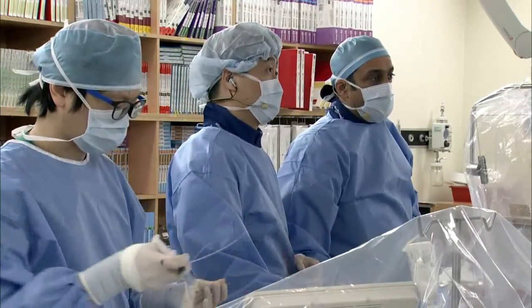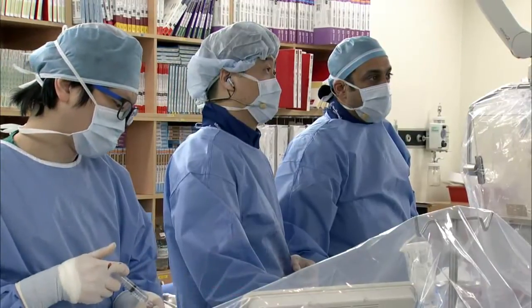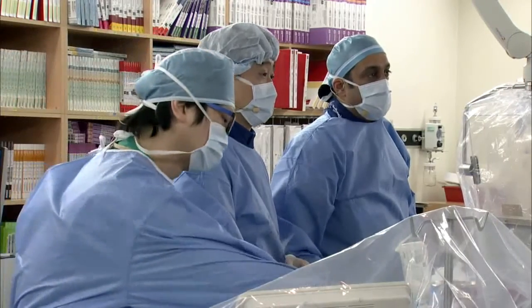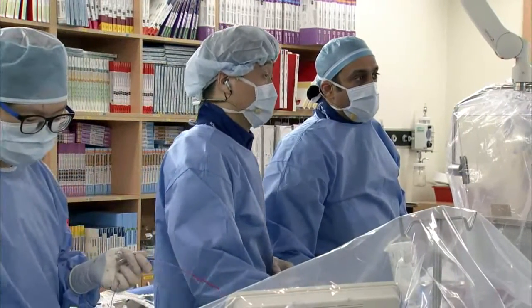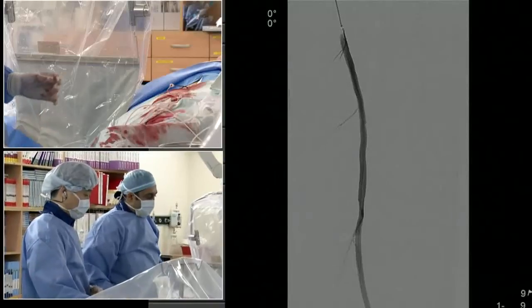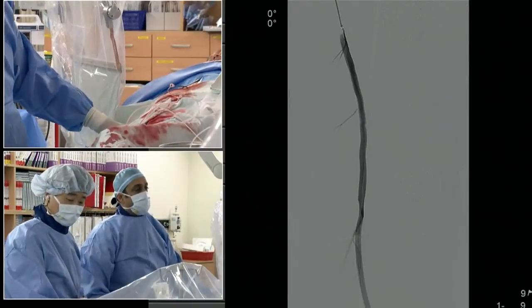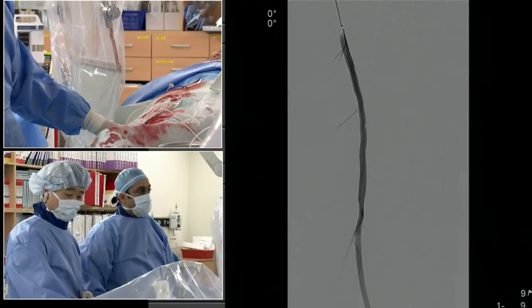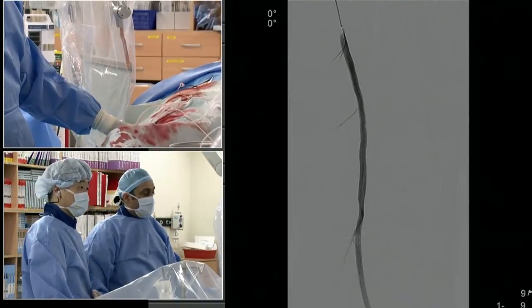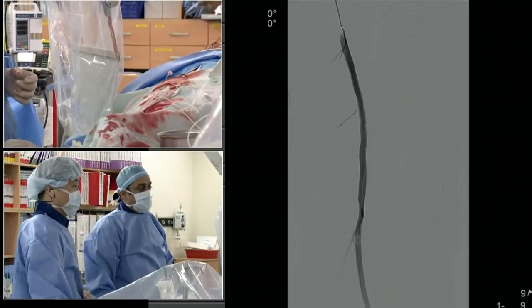So I'm going to take us back to where we left off last time. We had crossed and then we took a picture showing that we were intraluminal. And we had a few choices ahead of us as we had discussed earlier, and because of this concern about long stents and potential risk of restenosis and the problems treating that, we decided to go with atherectomy and drug-eluting balloon.